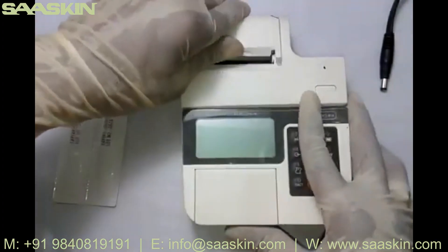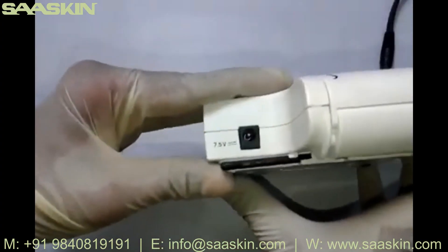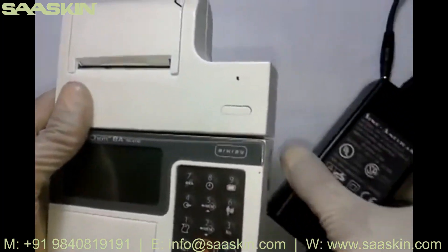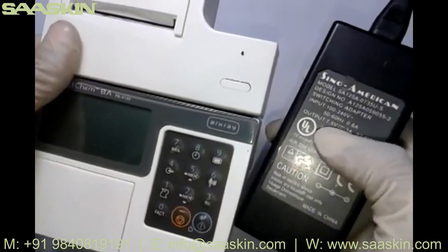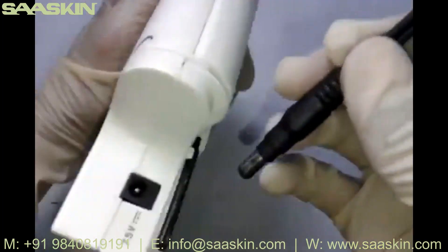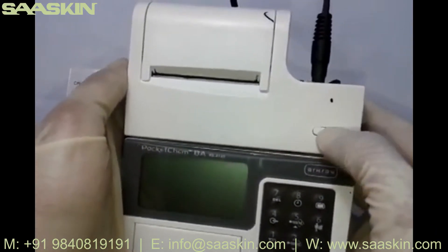The instrument is built-in with a thermal paper printer, as you can see. At the back side there is a connectivity port for power supply, which takes only 7.5 volts. Along with the instrument, an adapter is provided, also rated 7.5 volts. The back side port is where you connect the adapter.